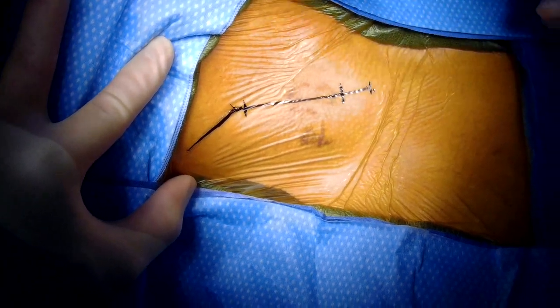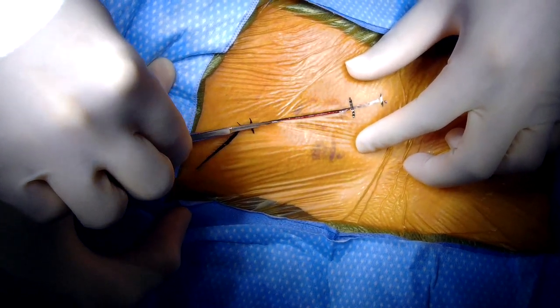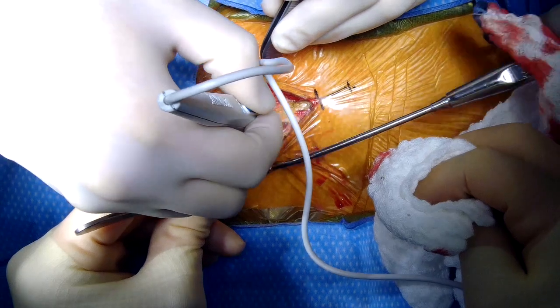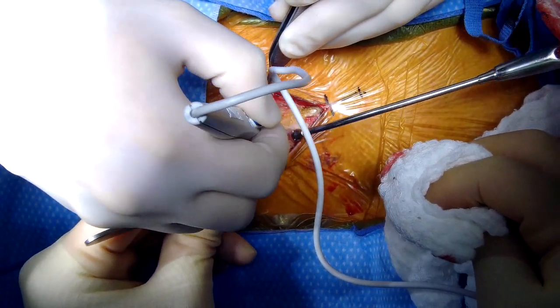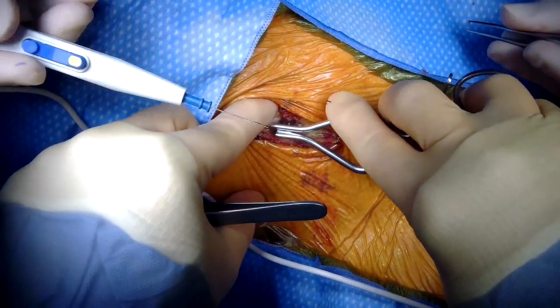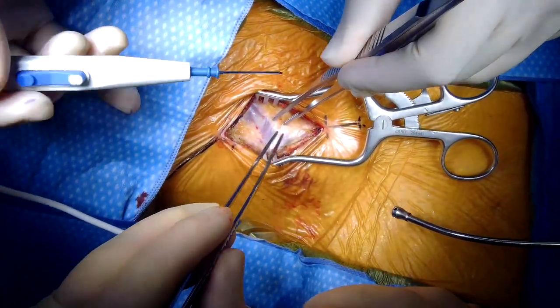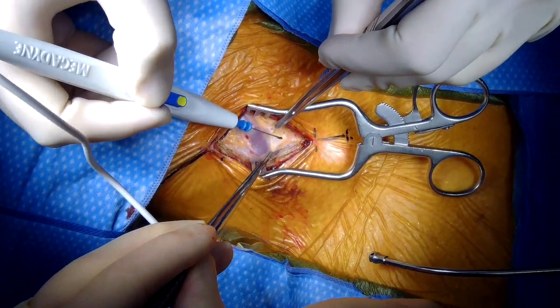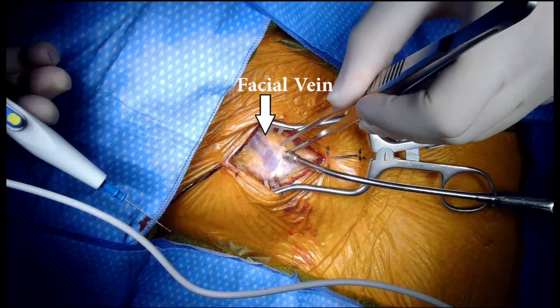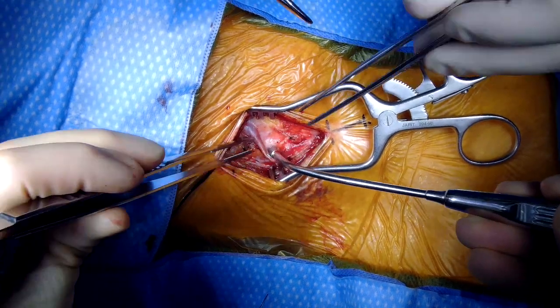A longitudinal skin incision was made overlying the anterior border of the sternocleidomastoid muscle with a 10-blade scalpel. This was deepened through the platysma with a combination of sharp dissection and electrocautery, exposing the sternocleidomastoid muscle, which was retracted laterally with the aid of a Weitlaner retractor. Dissection continued along the anterior border of the sternocleidomastoid muscle, revealing the underlying internal jugular vein. The facial vein was identified draining into the medial border of this structure, then dissected free and suture ligated using 2-0 silk ties.